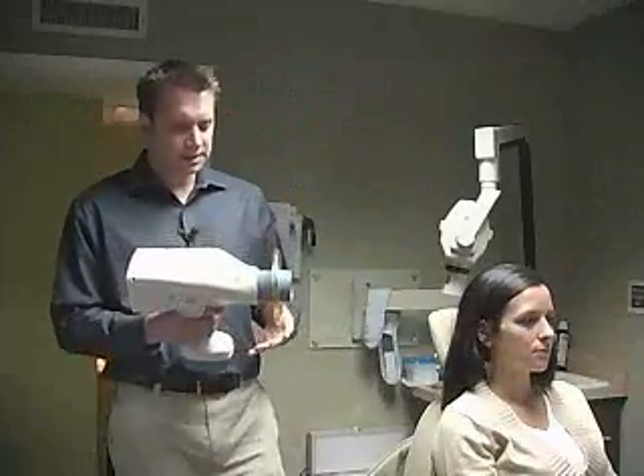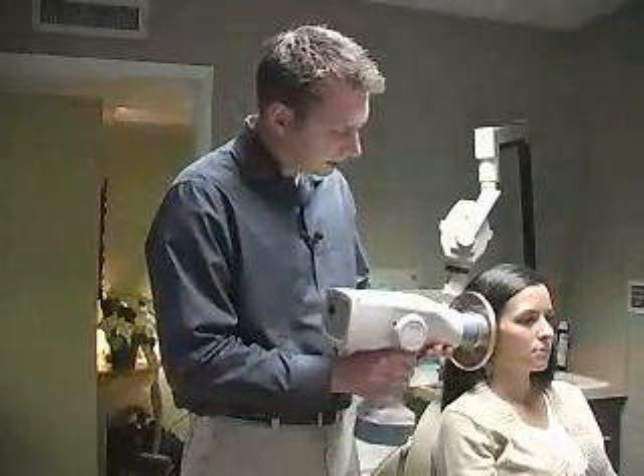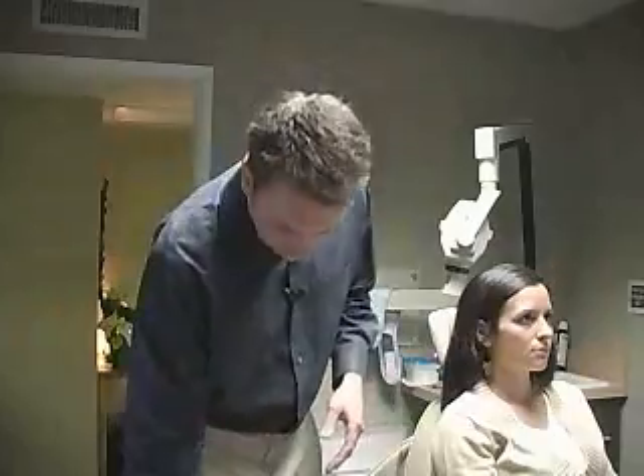The real convenience of this machine is that you're not tied to one particular room. I can just come in here, set up my patient, take an x-ray shot, simply put the unit down, readjust the film, pick the unit back up again, and I'm already on the same film. I haven't had to go anywhere.